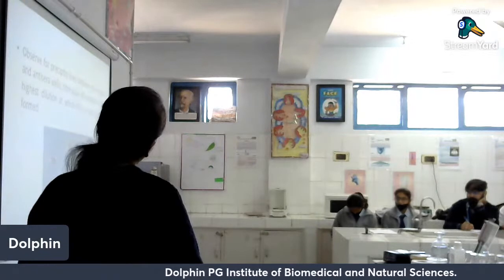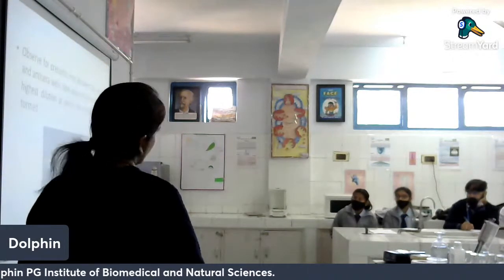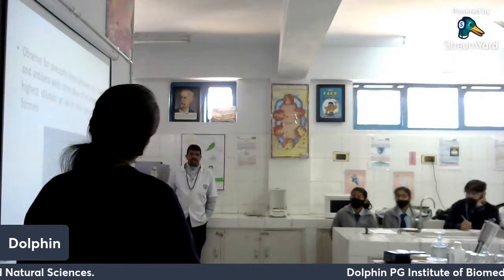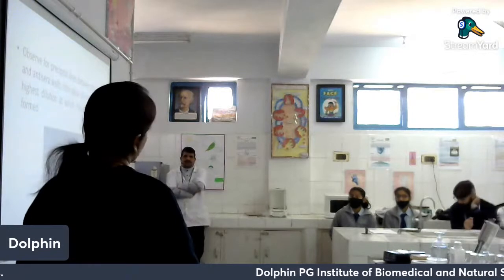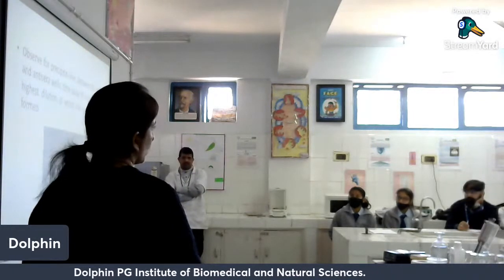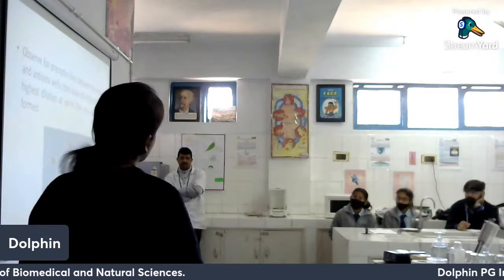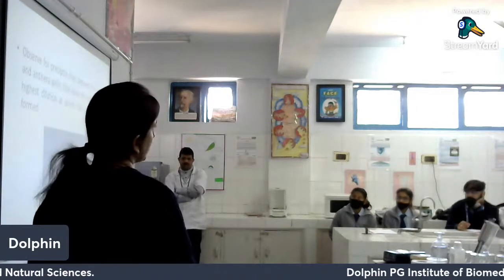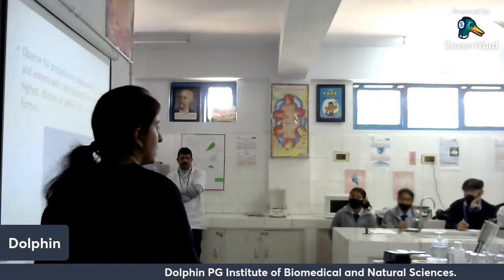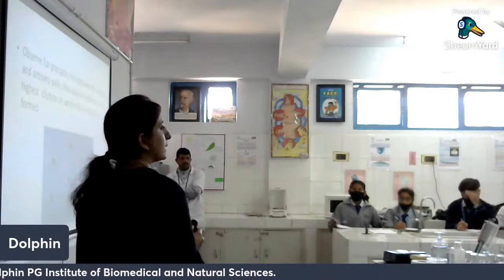sample. So here was the antigen. Here was the undiluted sample, 1:2, 1:4, 1:8, 1:16, and 1:32. According to this, we have a titer value of 1:8. Right? So this is the highest dilution at which the precipitin line is formed. That is the titer value of the anti-serum. So in radial immunodiffusion we get rings, in Ouchterlony we get lines.